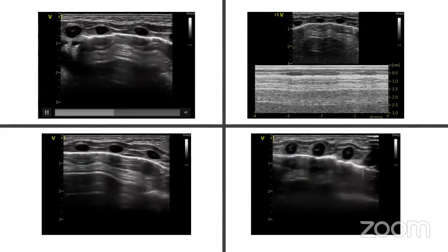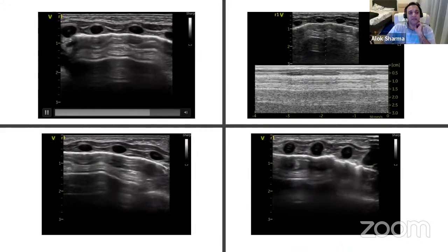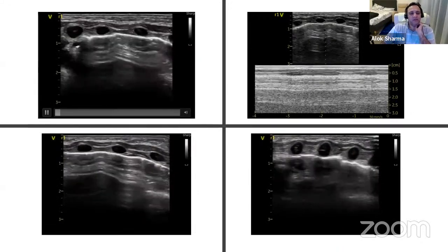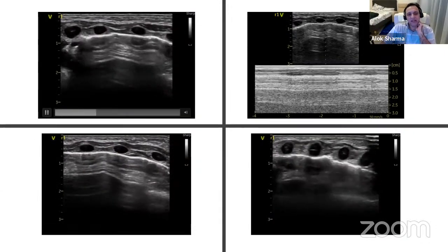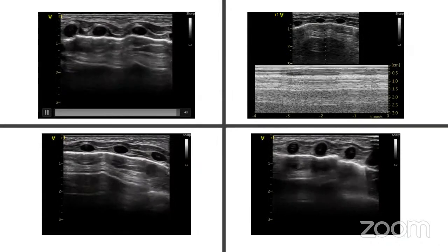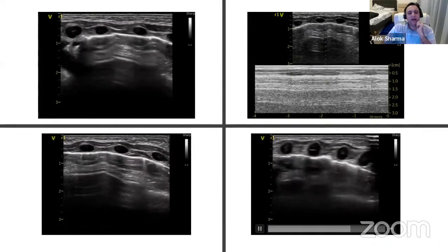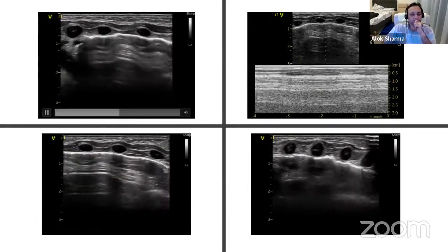The reason I've taken these four clips is because I'm using a hockey stick. And as you can see, the hockey stick is barely giving me about 3 ribs at this particular point. So you can say that this is R1, right upper, this is right middle, and this is actually also right middle. There's a slight difference, and there's a reason why I'm showing you these two.